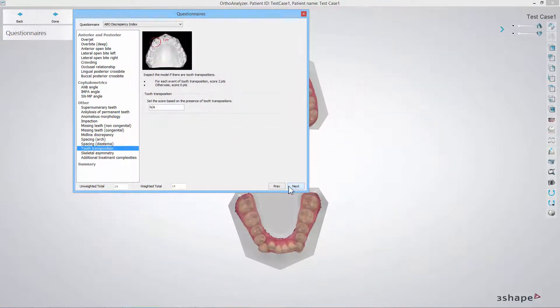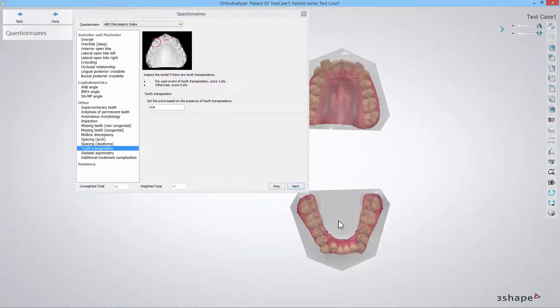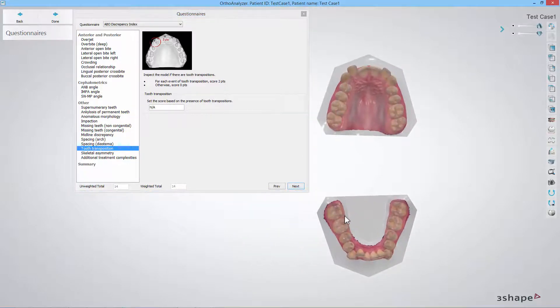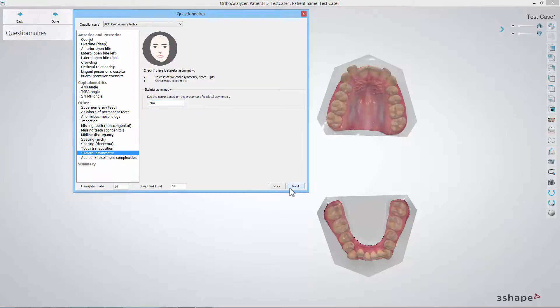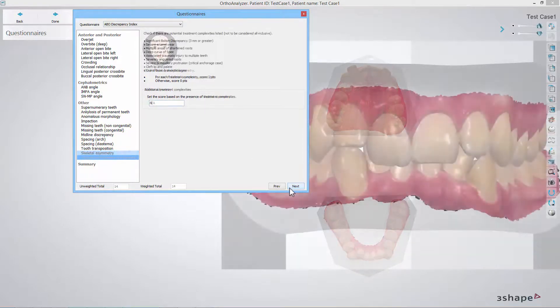In the tooth transposition step you should inspect the model for any tooth transposition. Please remember that this kind of workflow will repeat for the skeletal asymmetry step and the additional treatment complexity step.